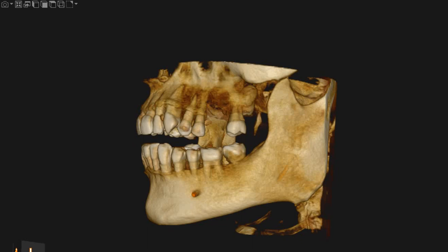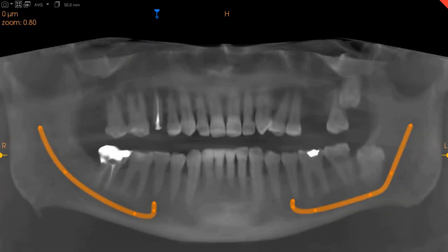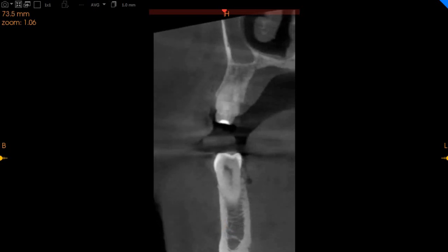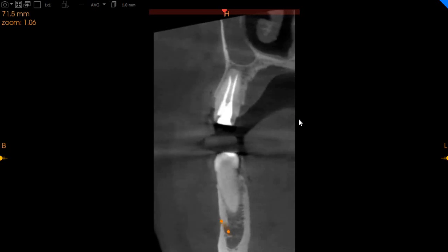The area of interest is the upper left 6, which is edentulous, and the upper right 5, which is endodontically treated. The upper right 5 has two canals. Both canals have been obturated. There is a radiolucency present on the mesial aspect of the tooth and there is a little bit of root resorption there as well.